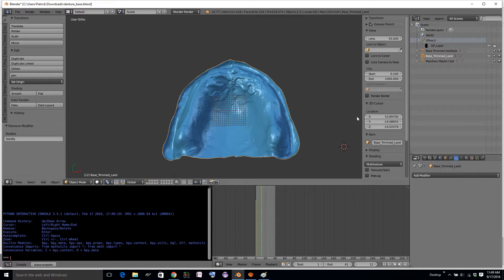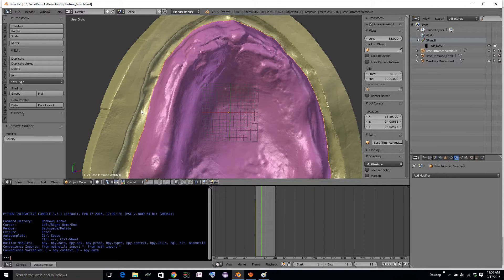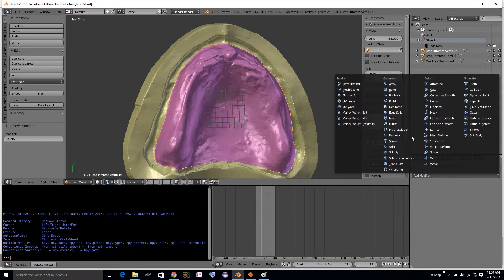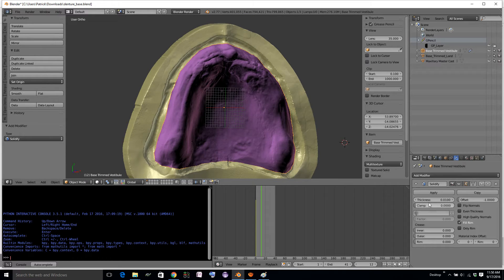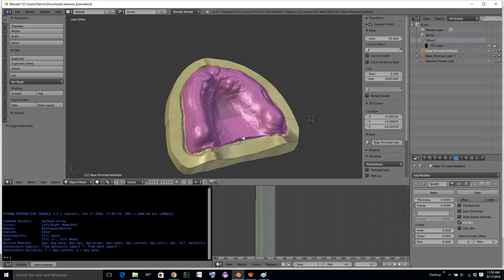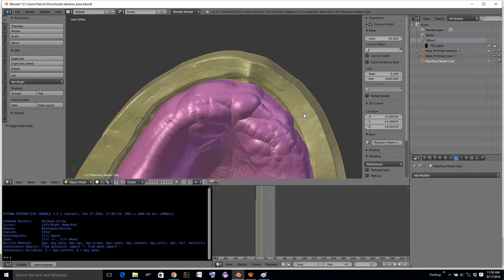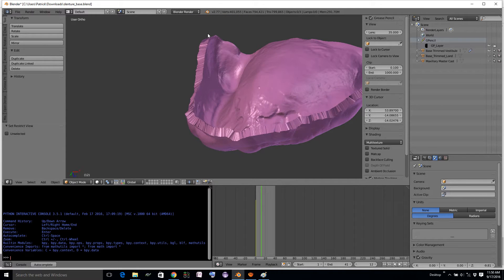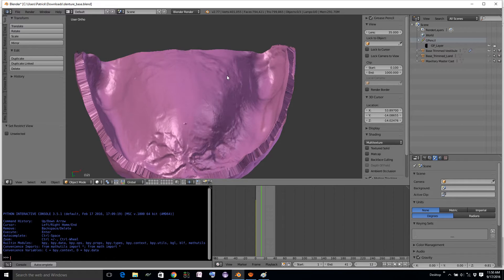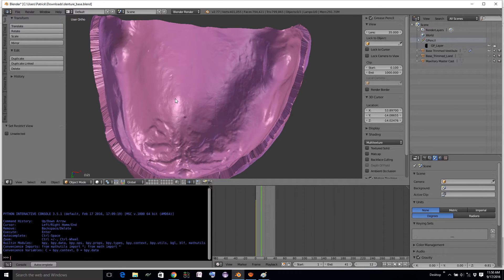One thing we've tried in the past to circumvent that is to trim the model at the vestibule. In that way, when everything offsets, you don't re-intersect back on itself. With a 2.5mm offset, this does a little better in terms of fewer self-intersections. We still self-intersect in the gingival detail, but one problem is that we don't get the nice rolled border — and that was part of the whole point of border molding. So this denture loses some of the anatomical features that are critical for a good clinical outcome.